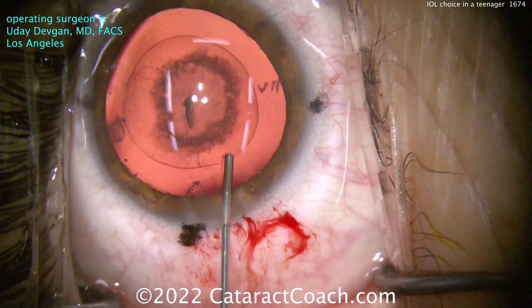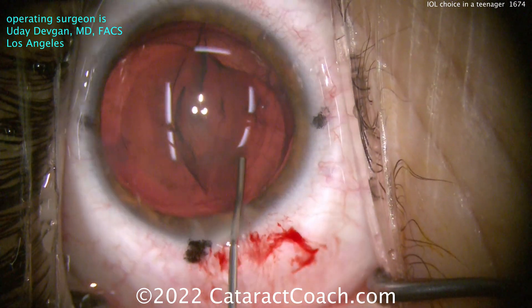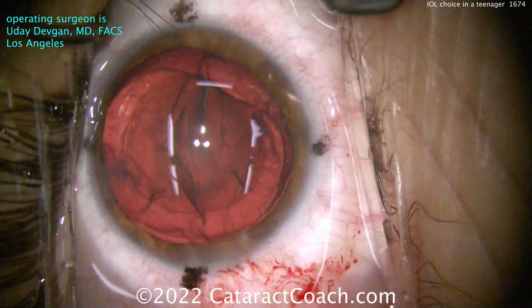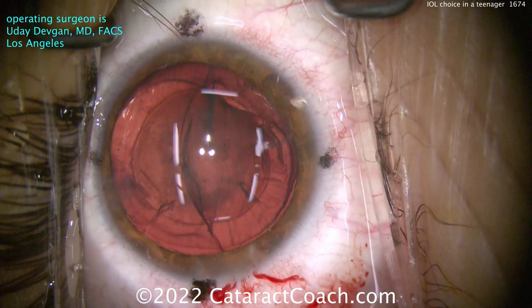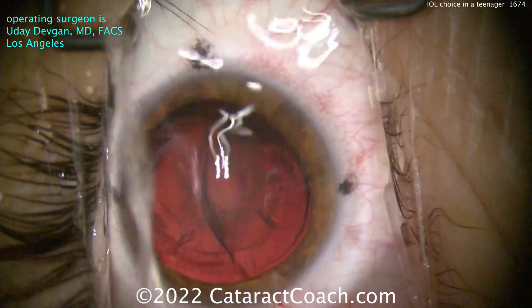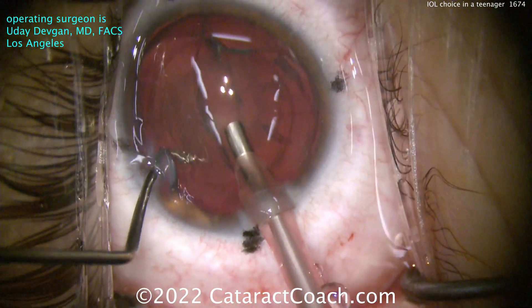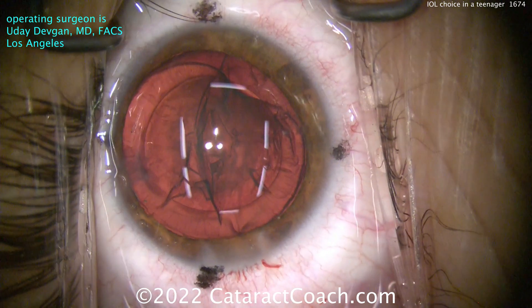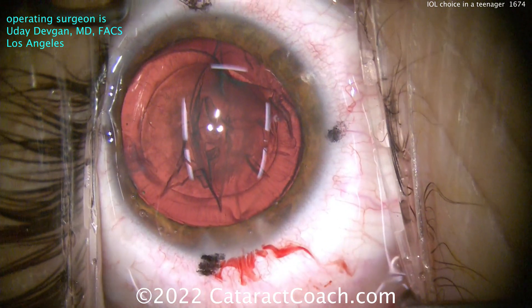I don't want the patient to have a small rhexis, so I definitely want a 5.5 rhexis. Here's some hydrodissection. This nucleus is, of course, butter soft — it comes out very easily. You don't even need a phaco probe; you can just take this out with the IA probe. Using the phaco probe for just a quick aspiration, this will come out in maybe a couple of seconds. Then switching to the IA probe — I like that change in game plan. It's a higher margin of safety.